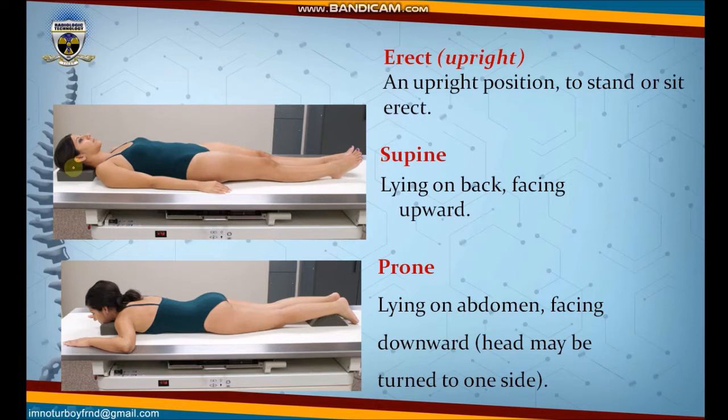That's why in the recumbent terminology, it is termed as dorsal recumbent, because the dorsal portion of the body is placed in contact with the table. Well, on the bottom part, you have here the prone position, which is a total opposite of the supine position. Prone position is lying on the abdomen facing downward. So if we have the back portion termed as dorsal, we have the front portion of the patient, which is also termed as the ventral. So in the recumbent terminology, we call this ventral recumbent.